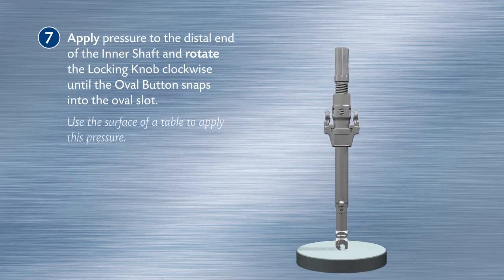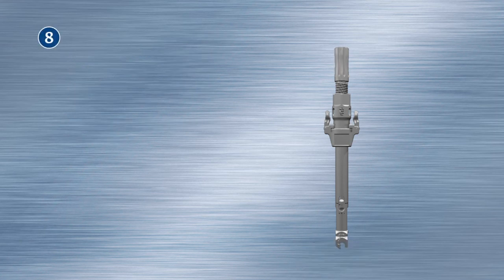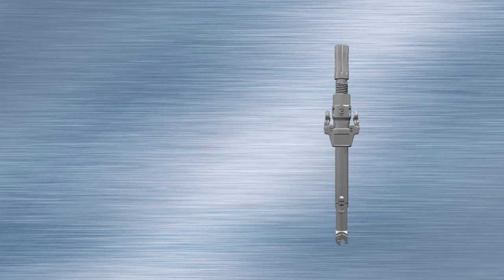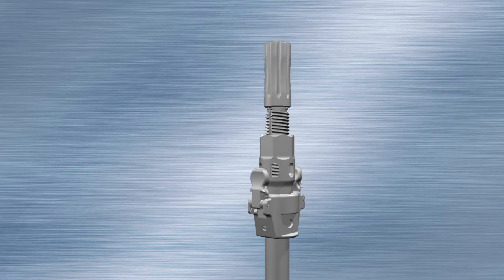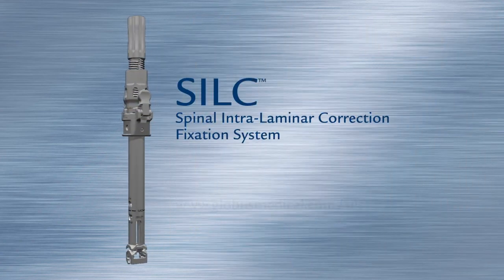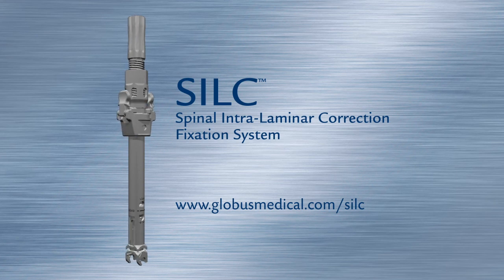Use the surface of a table to apply this pressure. Rotate the locking knob through all three positions — load, lock, and release — to confirm the tensioner functions properly. The implant loading jaw should travel up and down.